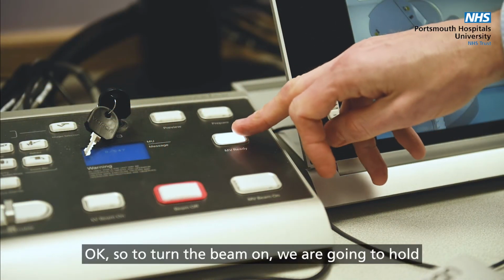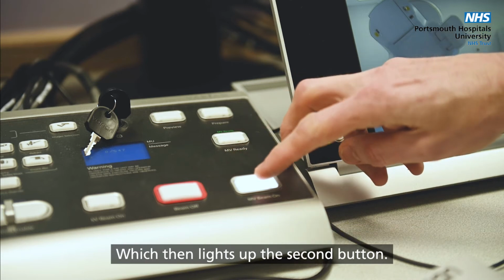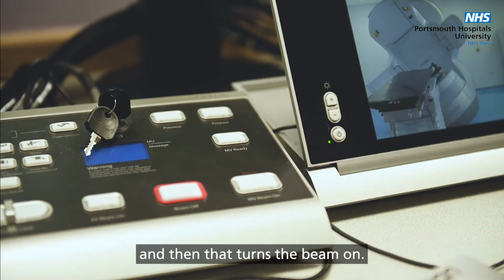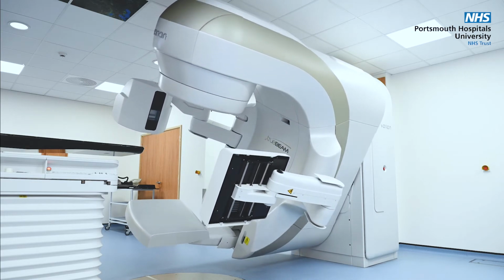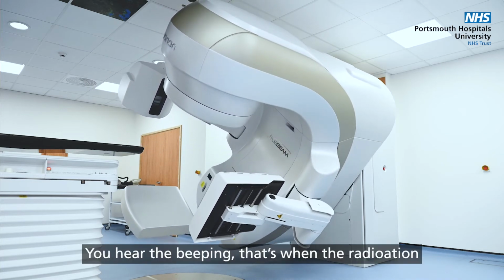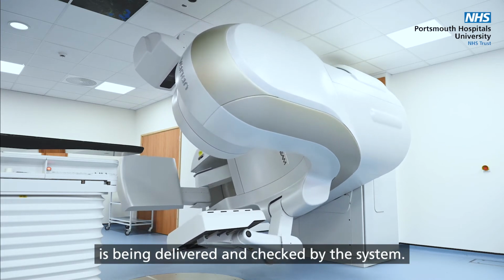Okay, so to turn the beam on, we hold this button down. It then lights up the second button and then that turns the beam on. So now it's delivering the dose of radiation. You hear the beeping, that's when the dose of radiation is being delivered and checked by the system.